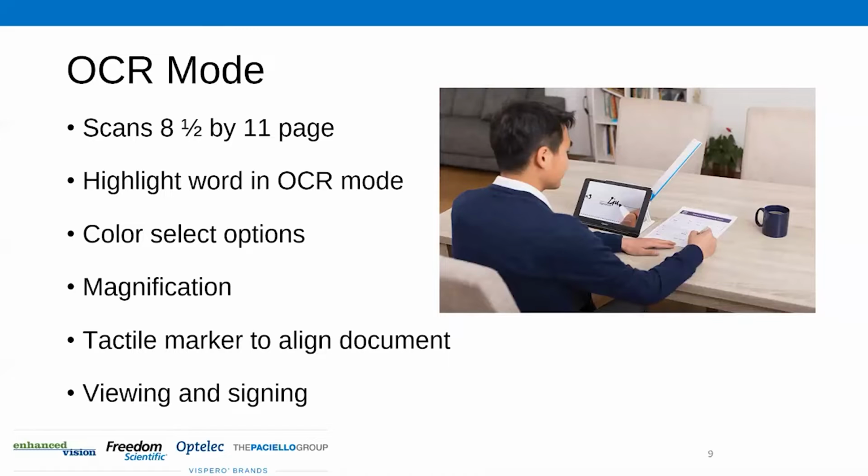Yeah, and I'd say on the OCR mode, one of the features I really like in this device is the ability to change the captured text. Sometimes when you do OCR mode, it will digitize the text, so it will physically take a picture of the text and put it in a digital mode, which can be very good, particularly if you're using high levels of magnification, because we can eliminate a lot of that distortion. But if you're trying to navigate, for example, a newspaper page where there may be an image or a chart that might need to be referenced, having that ability to do a live view image, particularly with this device because you have that extended camera, is a really nice addition.